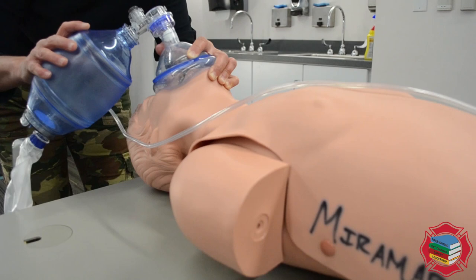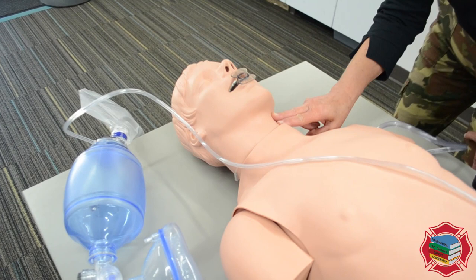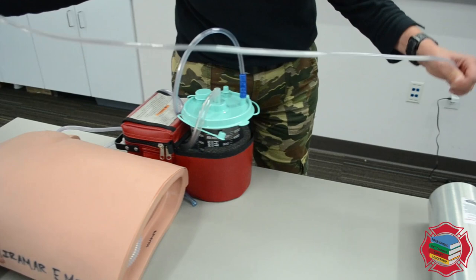Each ventilation is delivered over one second. Continuing: 1-1000, 2-1000, 3-1000, 4-1000, 5-1000. Two minutes have passed. I will recheck the pulse for five to ten seconds: 1-1000, 2-1000, 3-1000, 4-1000, 5-1000. The patient still has a weak pulse and no breathing.